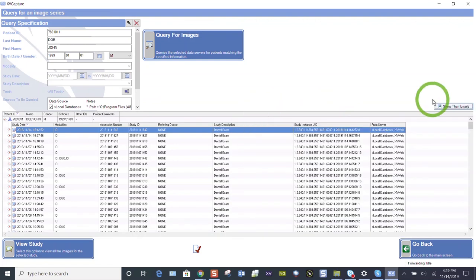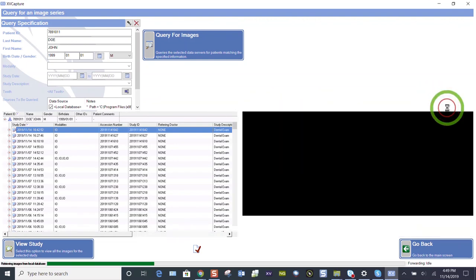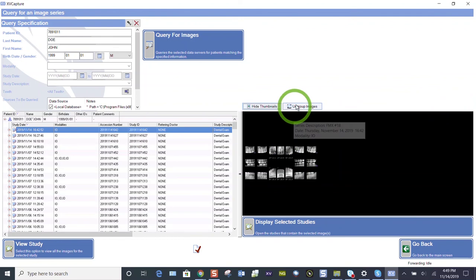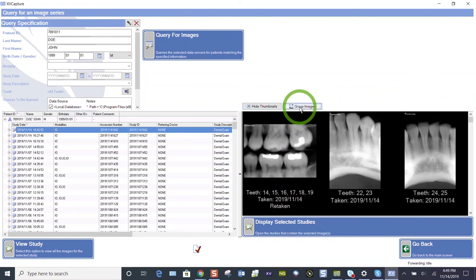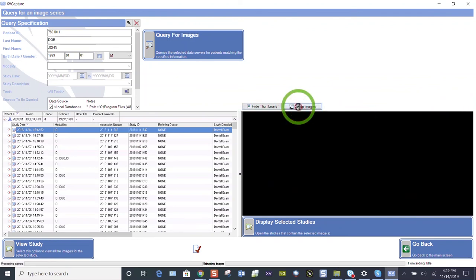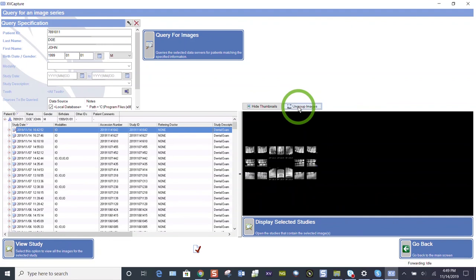So whether I choose to show my thumbnails or not, also your images may come in ungrouped, they may come in like this, just group those images.